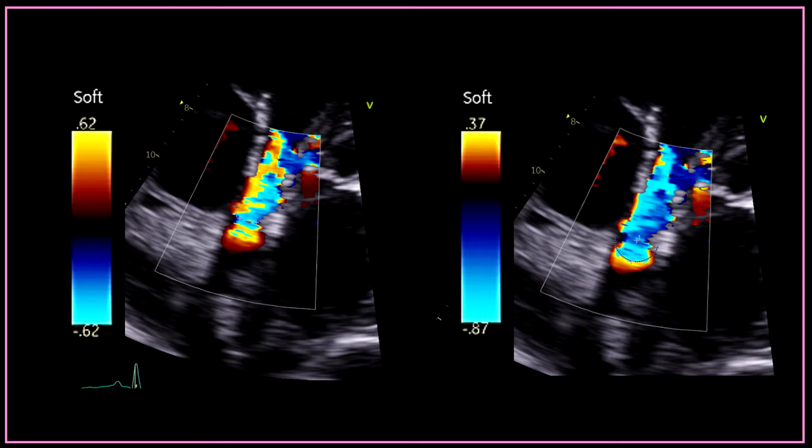That's why we have to adjust the baseline and the Nyquist limit, because as you can see, the hemisphere or the semicircle is better visualized and the borders are sharper on the image on the right side. And the borders are not well defined and they are very diffuse on the image on the left.